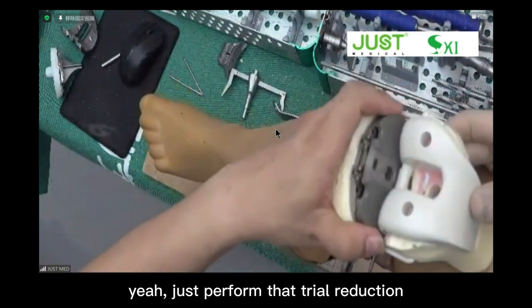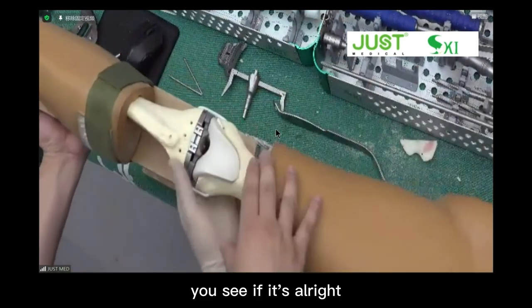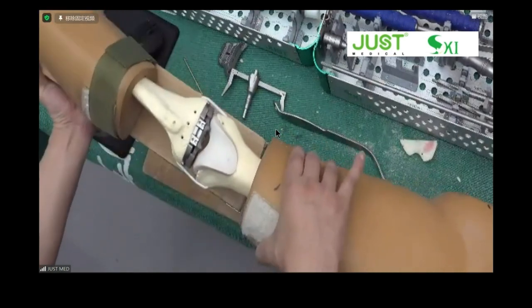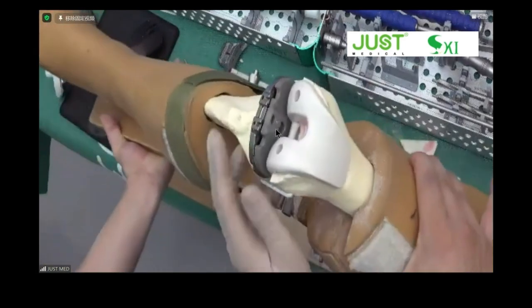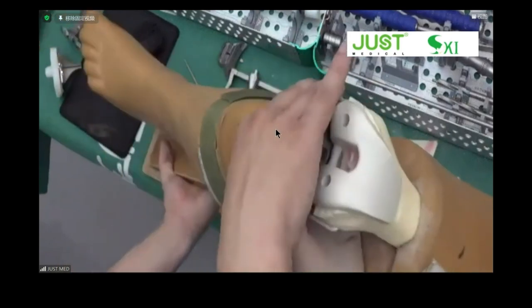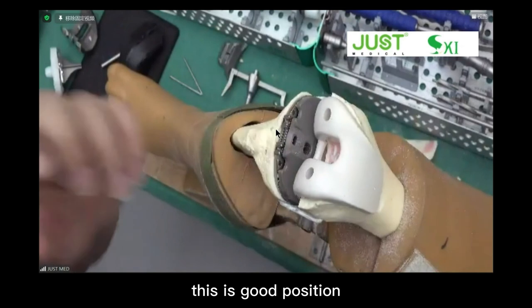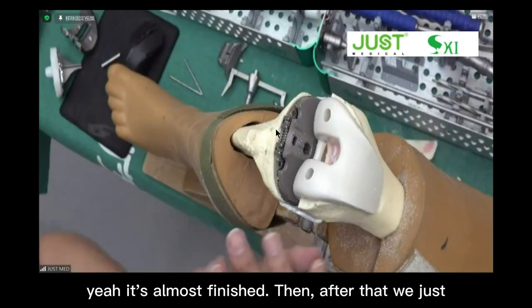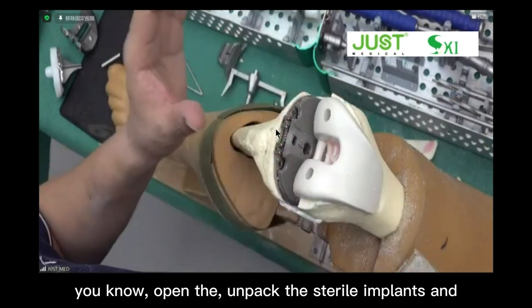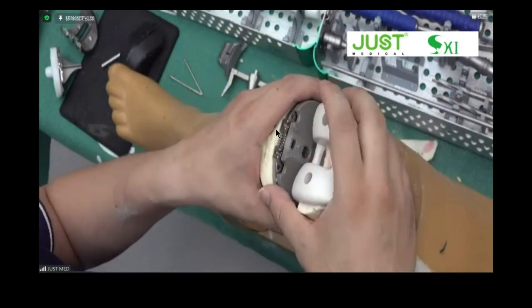Yeah, just to perform the trial reduction, to see if it's all right. Valgus angle, and the extension, flexion. It seems all right. Yeah, this is a good position. It's almost finished. Then after that, we unpack the sterile implants and apply the bone cement.